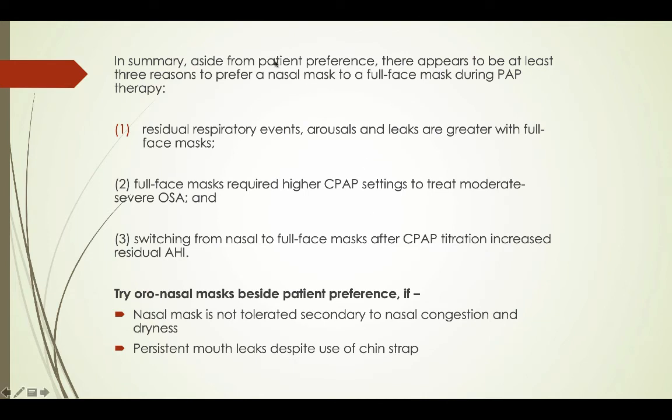So in summary, aside from patient preference, there appear to be at least 3 reasons to prefer a nasal mask to a full face mask during PAP therapy. Residual respiratory events, arousals and leaks are greater with a full face mask. Full face masks require higher CPAP settings to treat moderate to severe OSA, and switching from nasal to full face mask after CPAP titration increased residual AHI.